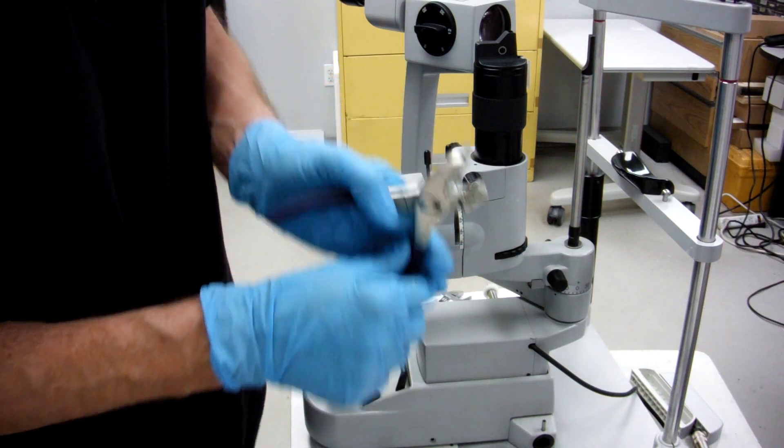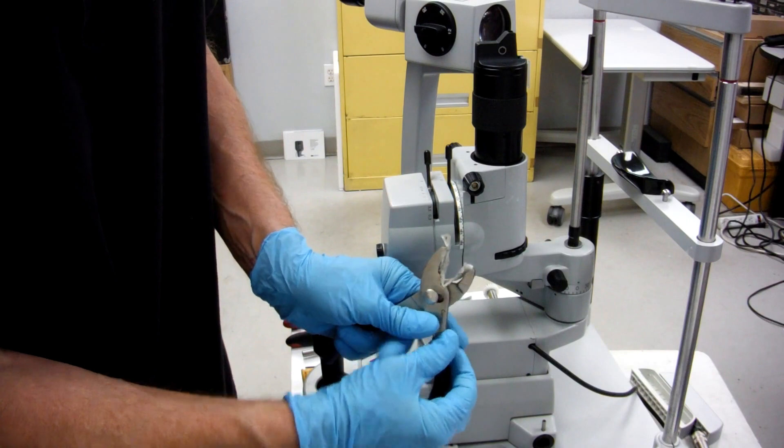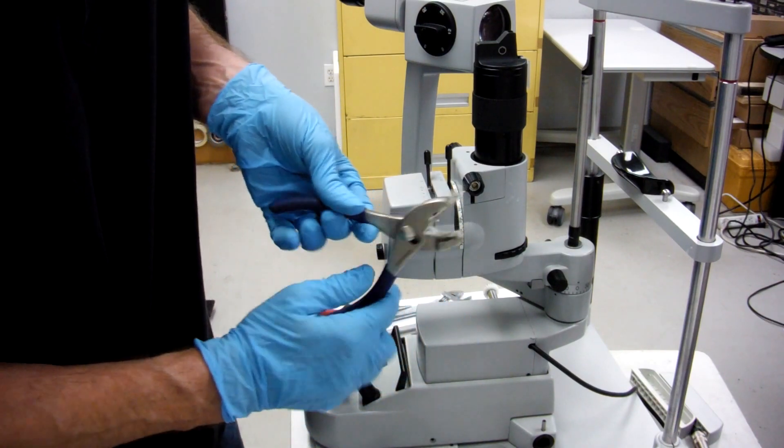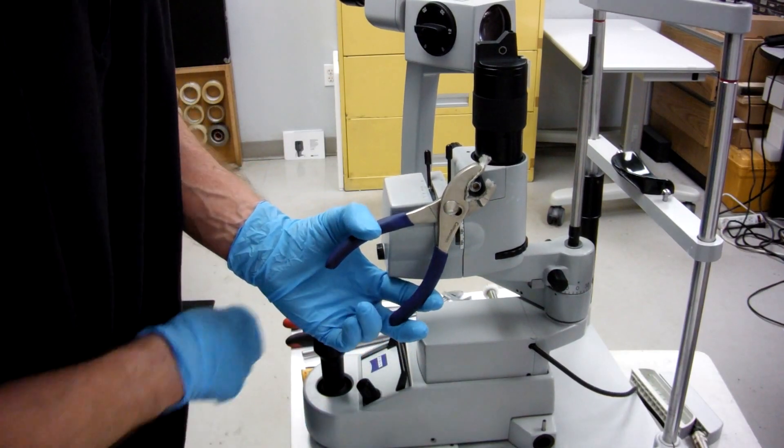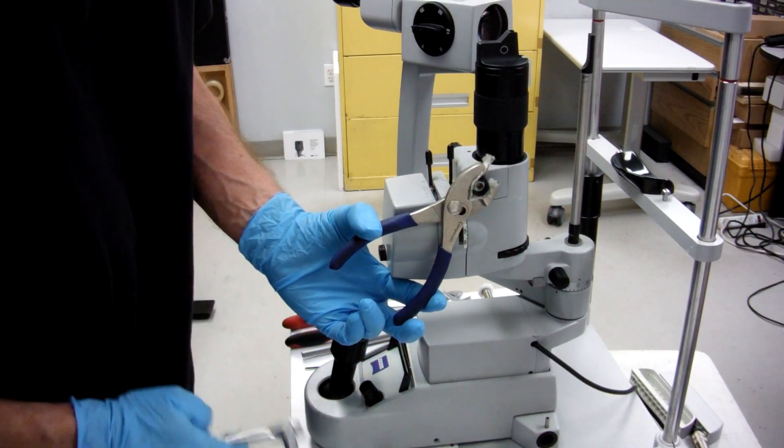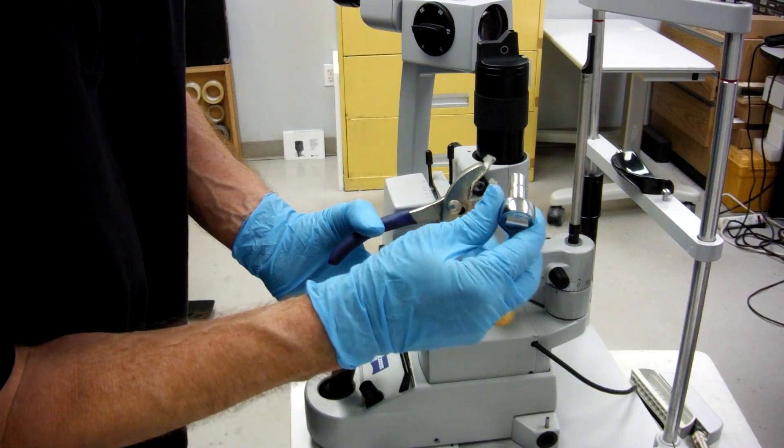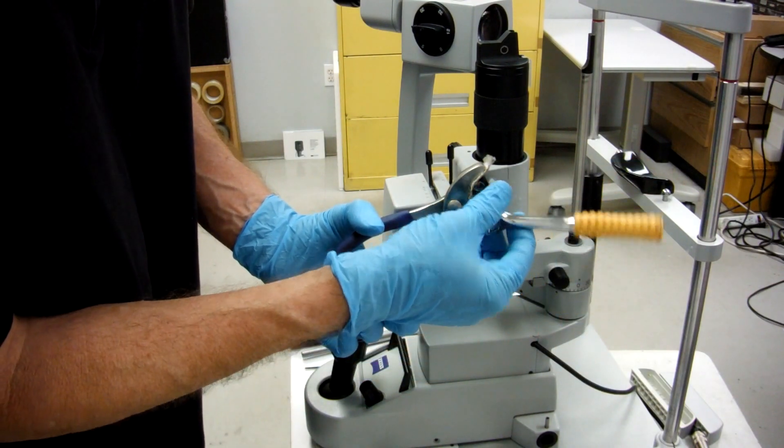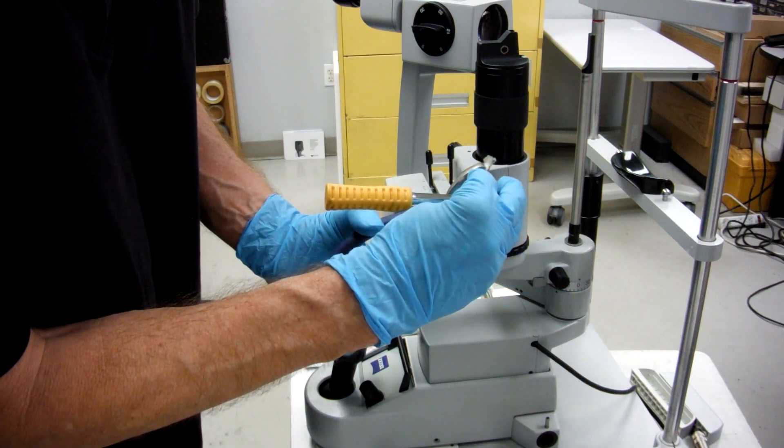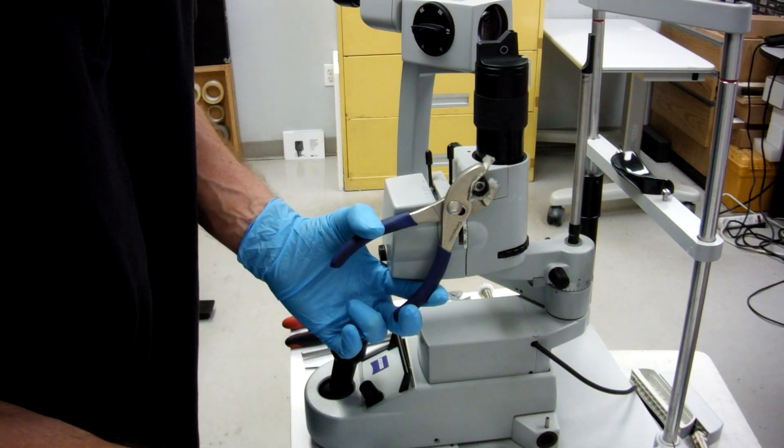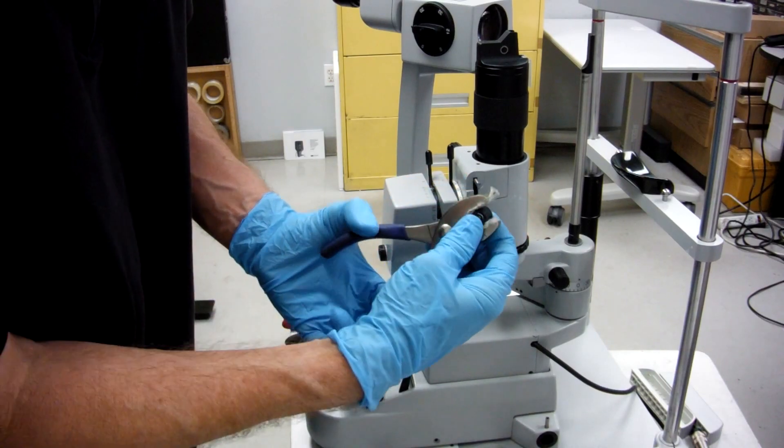To get those off, put something to insulate your pliers so you don't scratch up your knob. Hold it, get your socket. This is a 7 millimeter or 9/32nd. Loosen it, probably half is all you would need, and then you can pull it off.